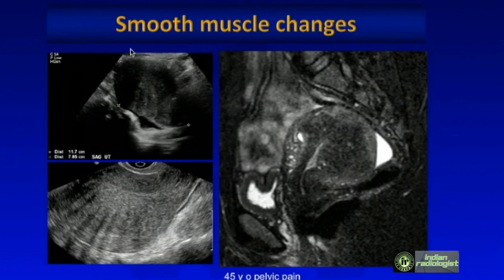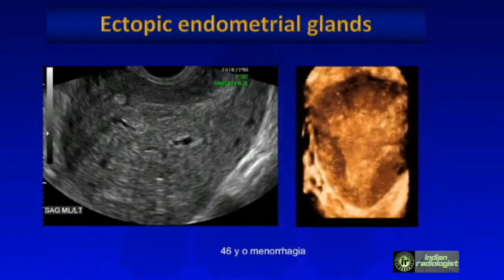Here is an example of smooth muscle changes: an enlarged, globular uterus with streaky shadowing from the posterior myometrium — the Venetian blind appearance. The MRI here confirms marked thickening of the junctional zone in this patient with adenomyosis, who presented with pelvic pain. Another example shows endometrial glands extending into the myometrium with echogenic nodules and lollipop-type cystic areas.